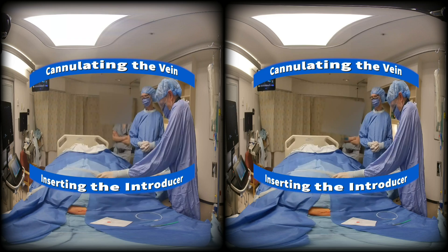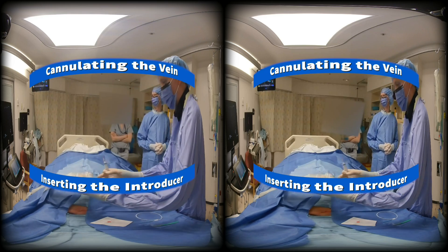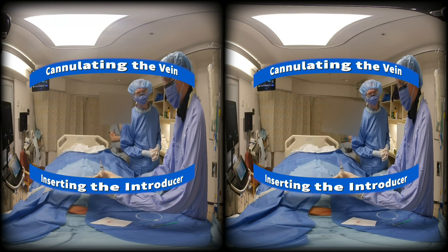Under ultrasound guidance, the right subclavian is cannulated and the introducer is inserted using Seldinger technique.